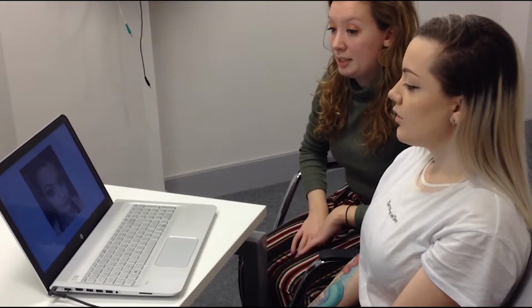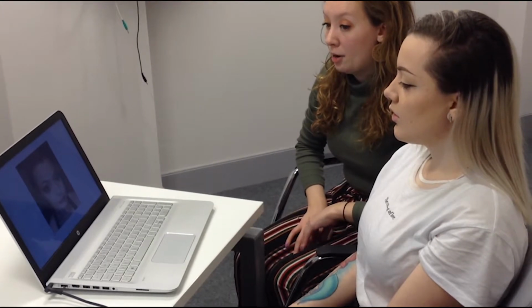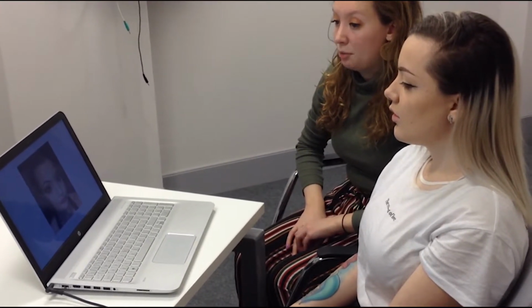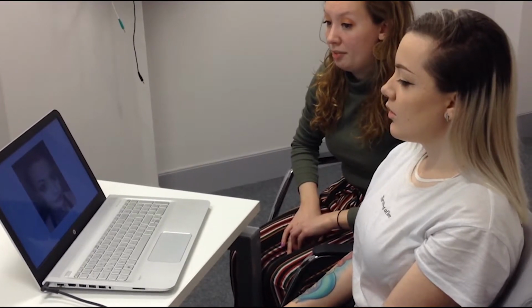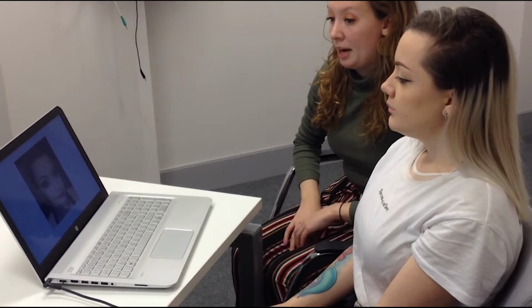This image begins the final irrelevant relevant series of the experiment, whereby the odd image is now taken out and the participant is presented with remaining irrelevant images and the image asked to keep in mind.